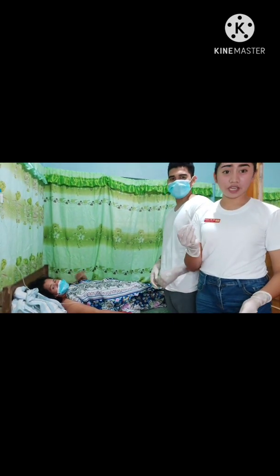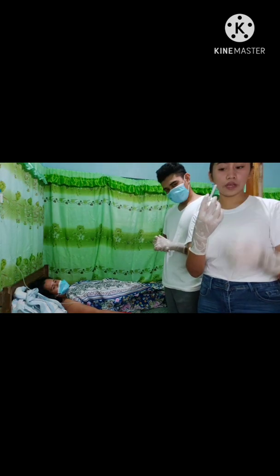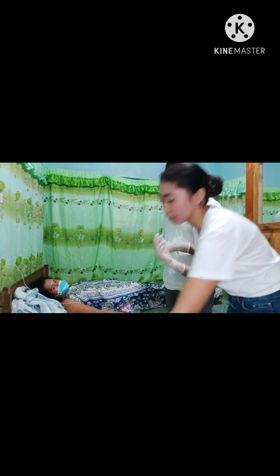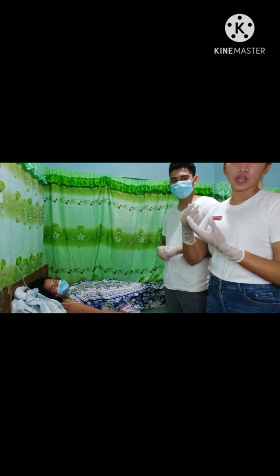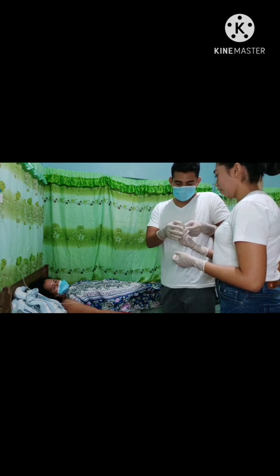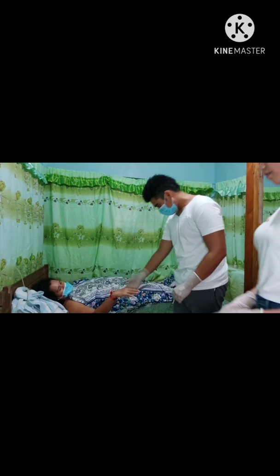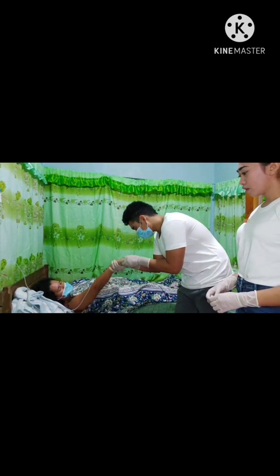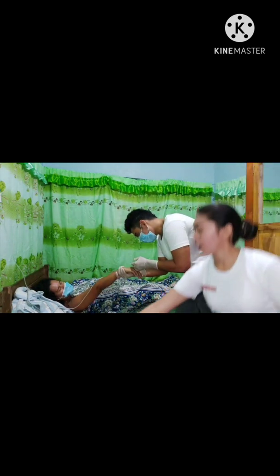After that, get the IV cannula, and when you see there's a butterfly in it, open it and then remove the cap. Upon removing, you must give this to the doctor with the sharp end in your direction. Be careful not to touch the cannula. We should prepare the sharps container.